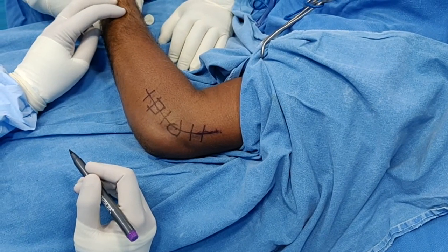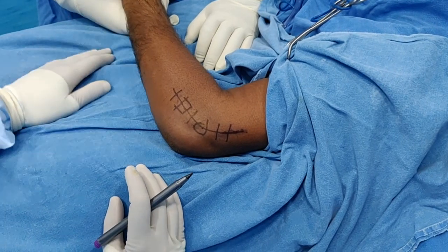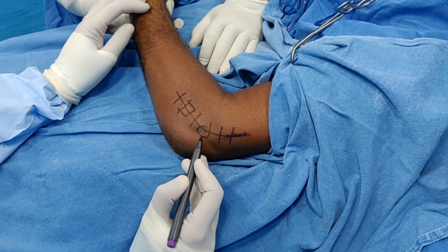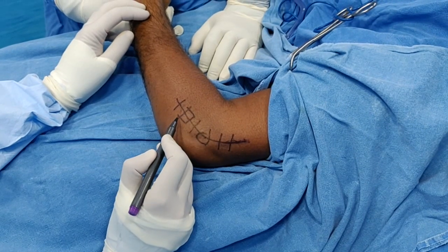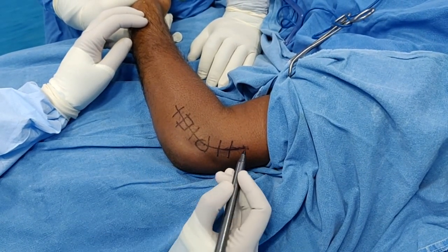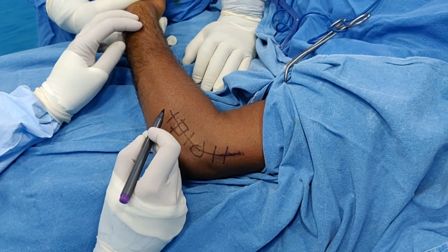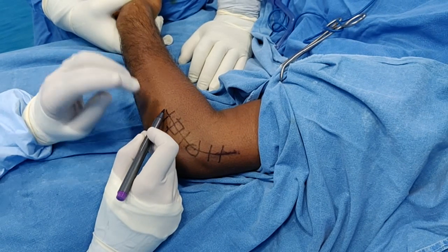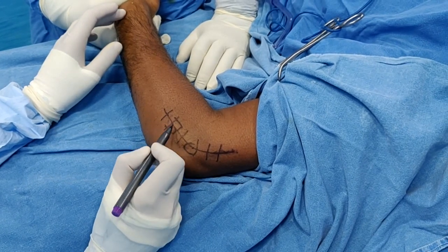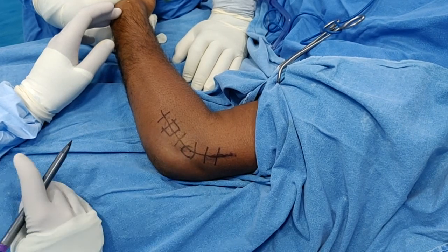Our patient is now anesthetized and we have used a tourniquet. The arm is on an arm table. New landmarks are the lateral epicondyle and radial head; this is the lateral supracondylar ridge. The incision runs over the lateral supracondylar ridge, starting proximally down to 2 centimeters distal to the radial head, centered directly over the lateral epicondyle.